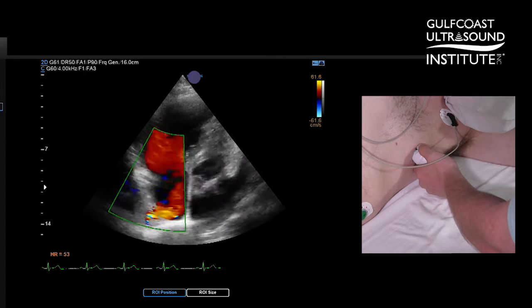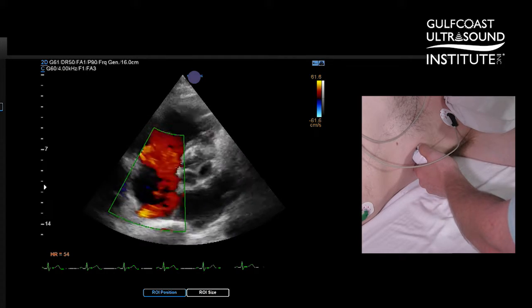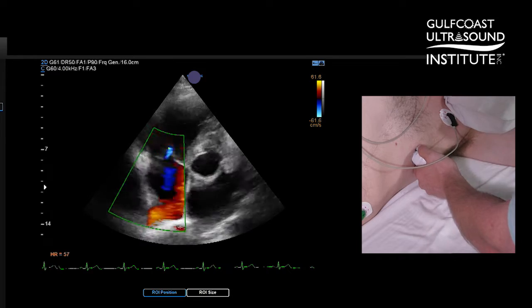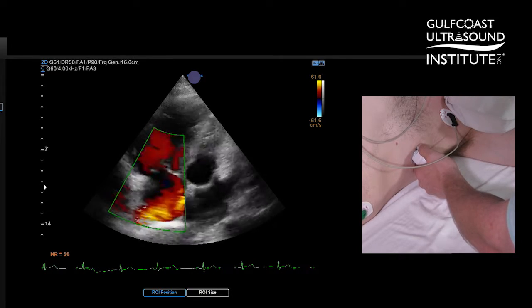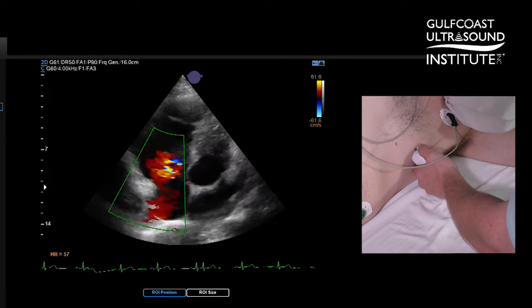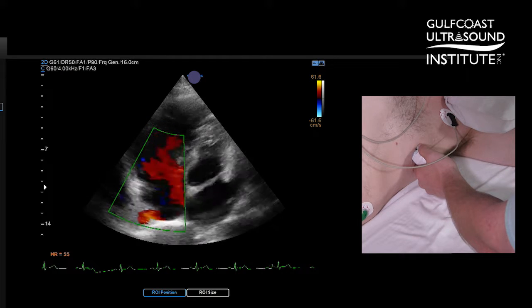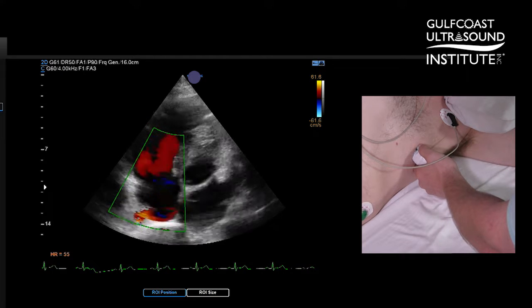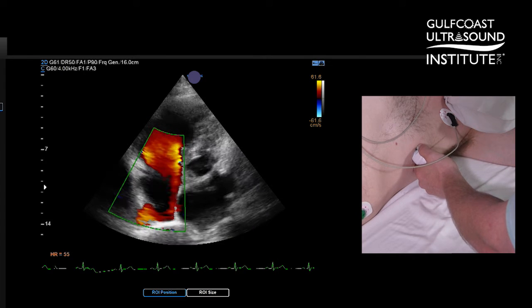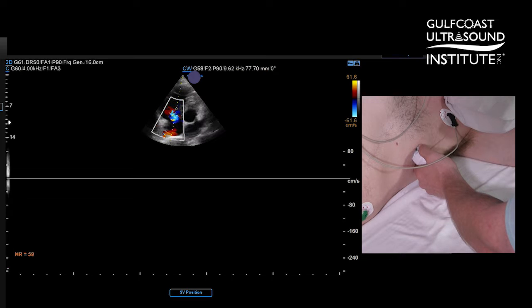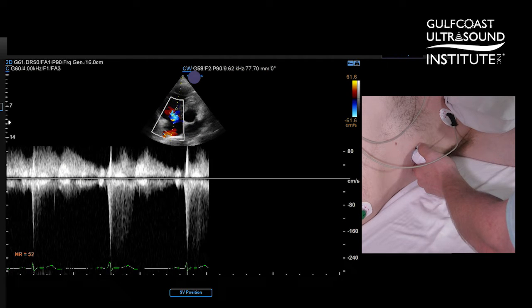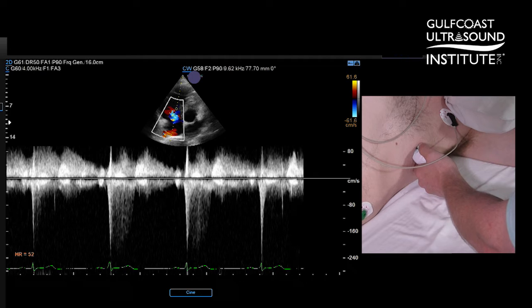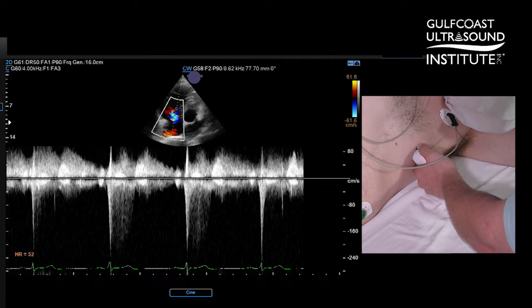Making sure that I'm looking right at the insertion of the jet itself — that's where we want to line up our continuous wave cursor so we can get the best jet. Activate our cursor and we can see now there actually is a TR jet that we can measure.